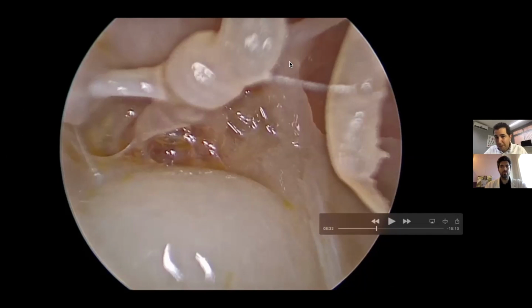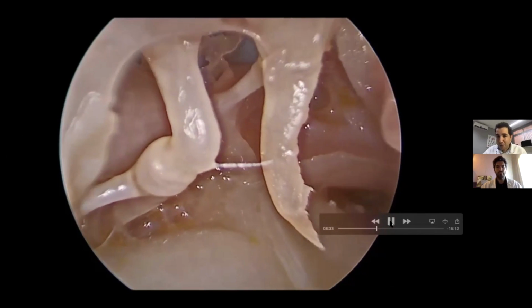So also we scan here the cochleariform process, the malleus, incus, stapes, anterior crus, posterior crus, and right below we can see the Jacobson nerve. The Jacobson nerve is very interesting and very nice to see in a cadaver or in real life.